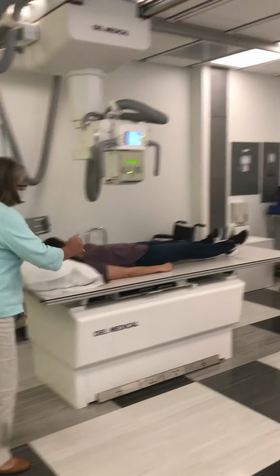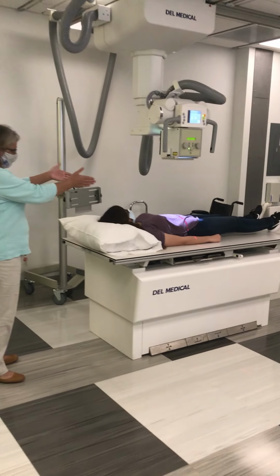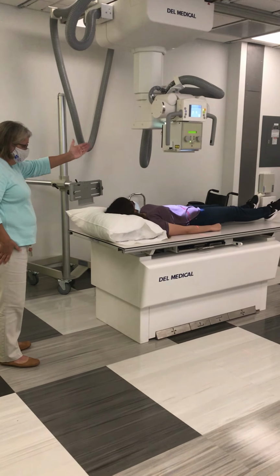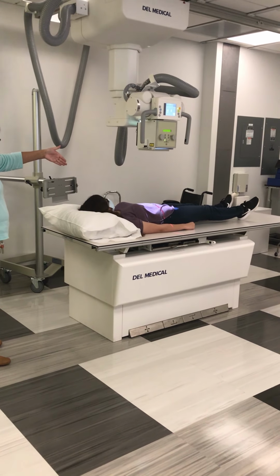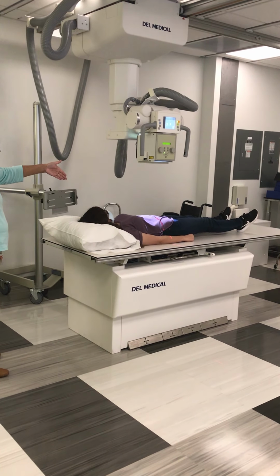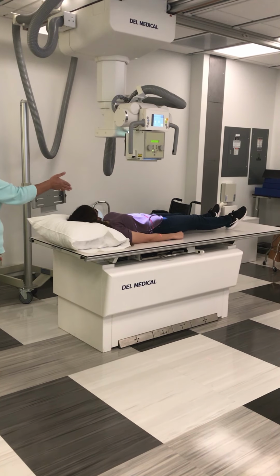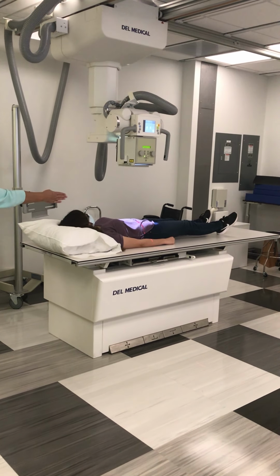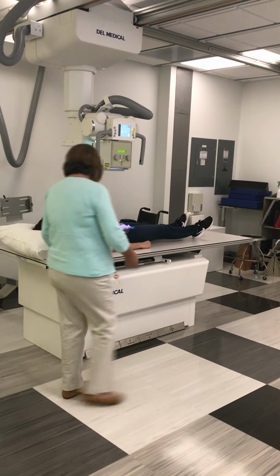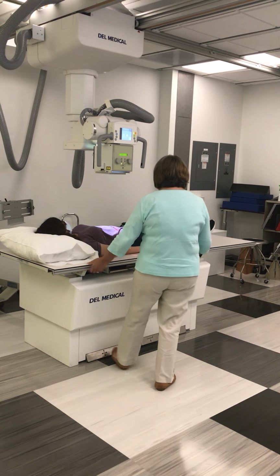Then I come up to the head of the table to verify that I'm centered in midline. Looking at the light, I should see an equal amount of light. So where the edge of the light is on the left to her hip, that space should be the same as the edge of the light on her right to the right hip. Just a teensy bit off center.